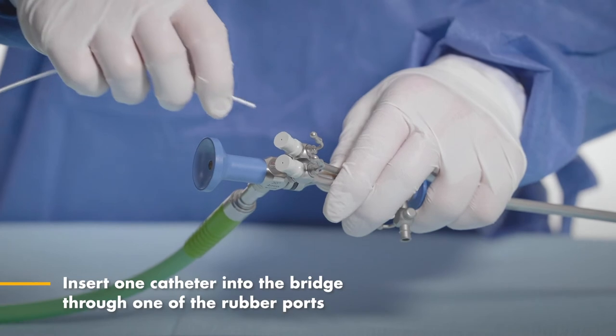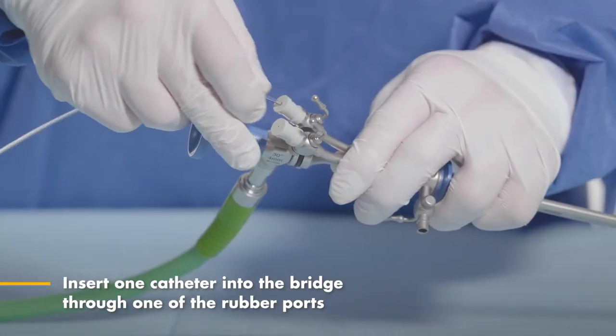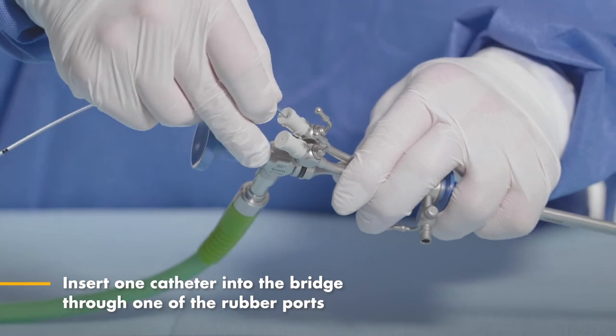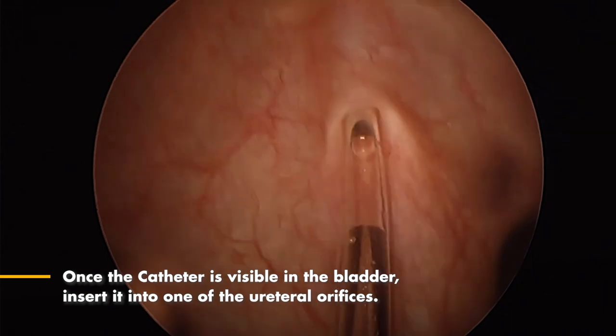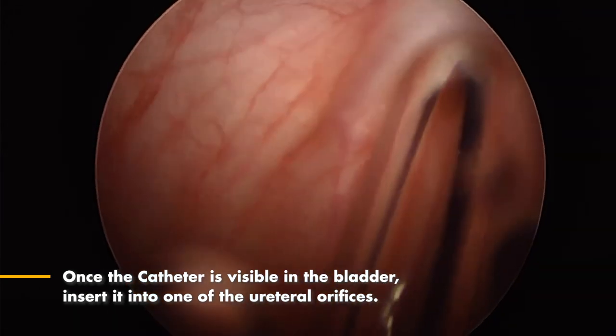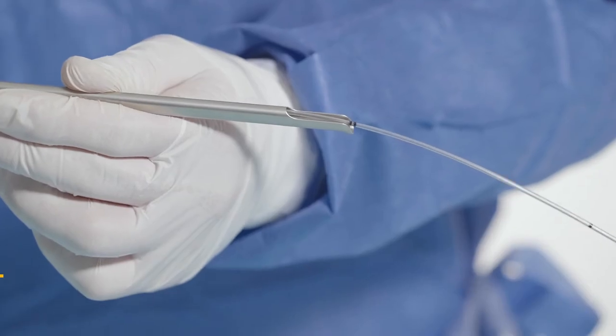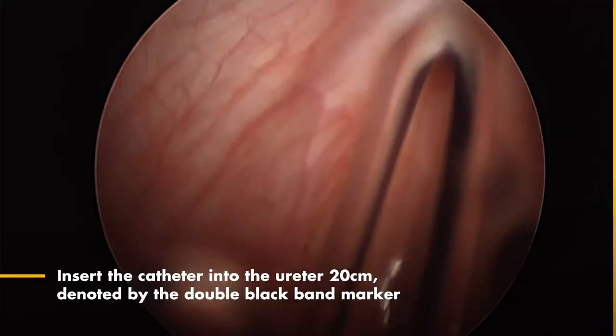Insert one catheter into the bridge through one of the rubber ports. If there is difficulty inserting, coat the catheters with standard lubricant. Once the catheter is visible in the bladder, insert it into one of the ureteral orifices. Advance the catheter 20 centimeters — this distance is marked on the catheter with double black bands.